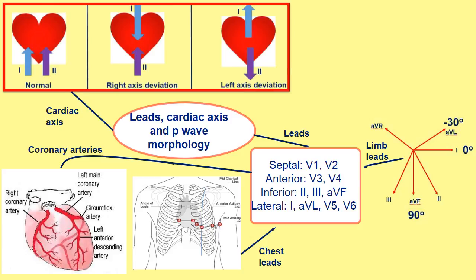We talked about cardiac axis. We talked about the love story. Both of them are pointing upwards in the same direction, lead 1 and 2. Both of them are positive, that's a normal relationship. And if one is pointing down and 2 is pointing up, there's now deviation in their love, but it's still alright because both of them are still meeting.